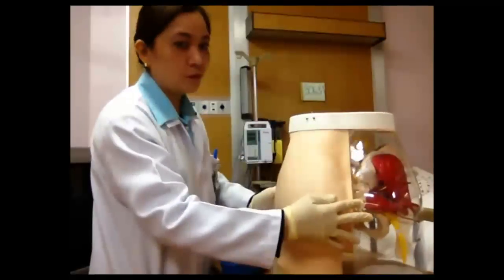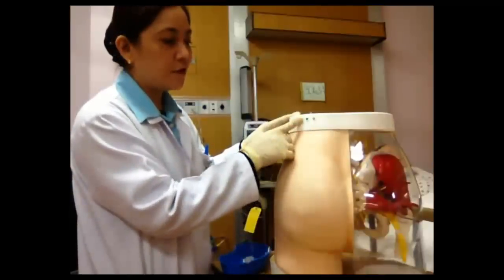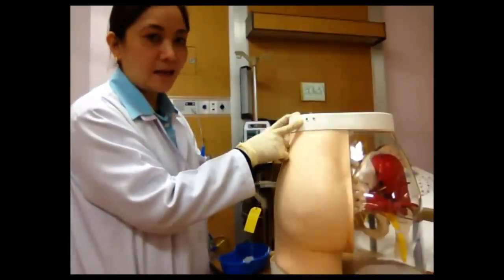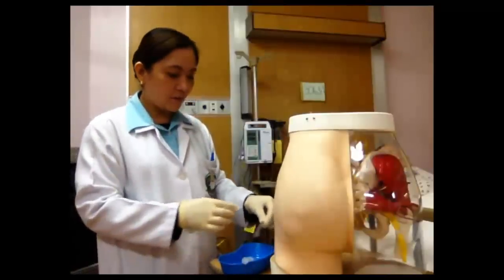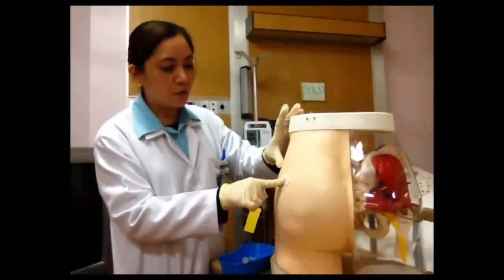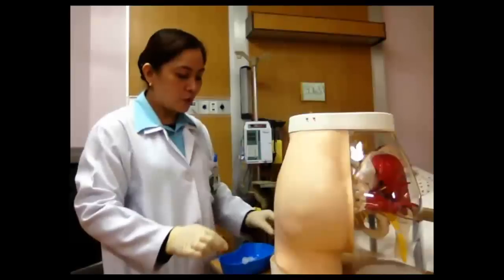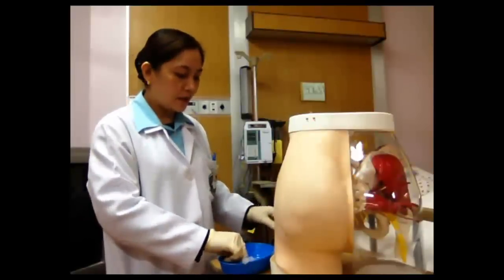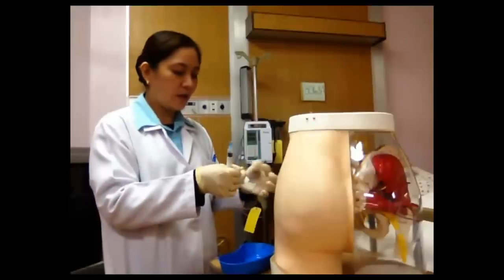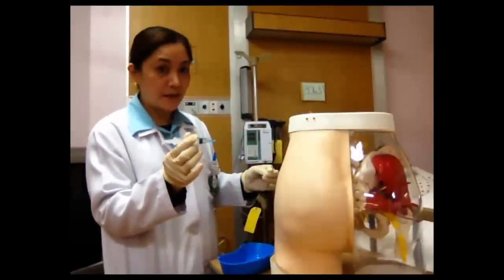Okay, so I'm going to show you the other side of the buttocks. We have here the indicator, the green and the red light. If the red light signals, that means we are at the wrong site of injection, but if the green light signals, that means we are at the correct site of injection. So again, we have to clean the area using alcohol wipes in a circular motion from inside to outside, about 1 to 2 inches in diameter. Then get your medication, open another alcohol wipe and keep it ready with you. In a dart, quick manner, you have to inject this medication.